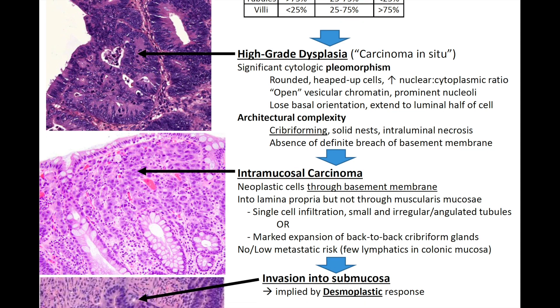In adenomas, by definition they are low-grade dysplasia, but you can have high-grade dysplasia or carcinoma in situ. In these cases you're going to have significant cytologic pleomorphism — rounded, heaped-up cells with an increased nuclear-to-cytoplasmic ratio, open vesicular chromatin with prominent nucleoli, and you're going to lose that basal orientation extending to the luminal half of the cell. In high-grade dysplasia you can also get architectural complexity such as cribriforming, solid nests, and intraluminal necrosis, with absence of definite breach of the basement membrane.